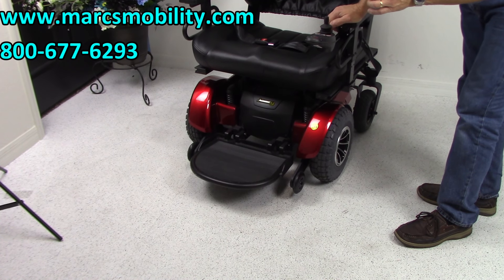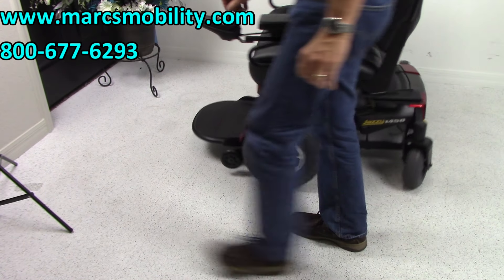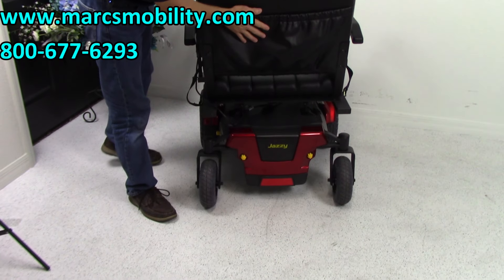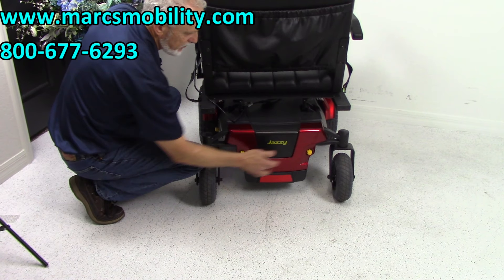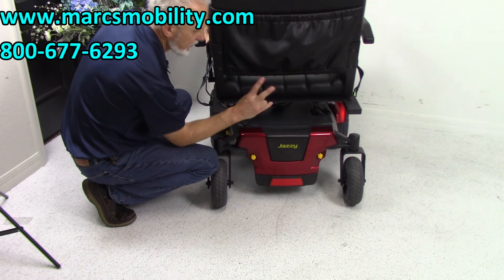The motors are a little bit louder than most because they're heavy-duty geared motors. At the back of the chair, you have a pouch where you can keep your charger. If you ever need to change the batteries, they come out from the back — just unscrew the two yellow tabs, the cover comes off, and the batteries slide right out. There are two batteries.